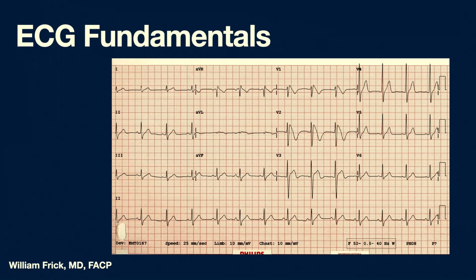It's an incredibly powerful and amazing tool. My feeling about ECG, at least for myself and my own experience, is that I always felt like there was a lot of background knowledge assumed about how ECG is performed. I remember being a medical student and hearing the lecturer talk about the directionality of the ECG and the propagation of the wavefront, and I had no idea what he was talking about. That just seemed like gobbledygook to me.